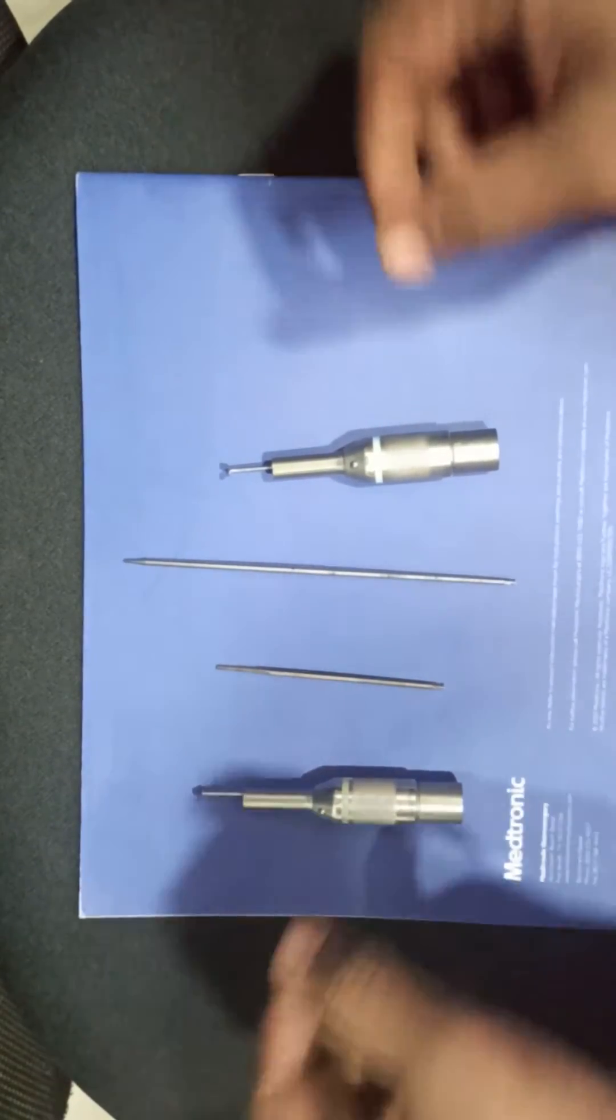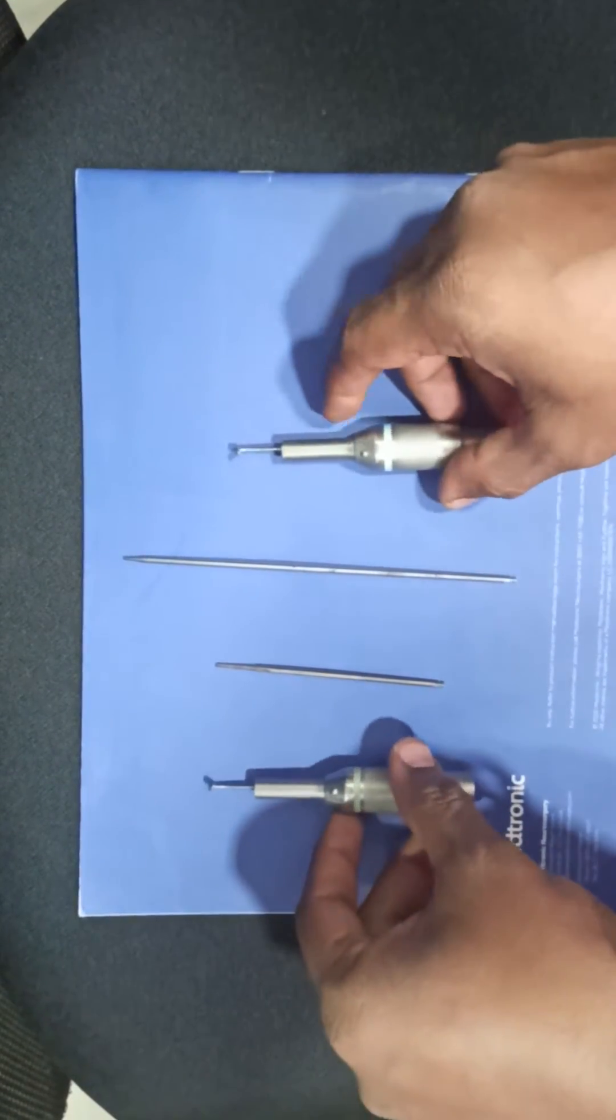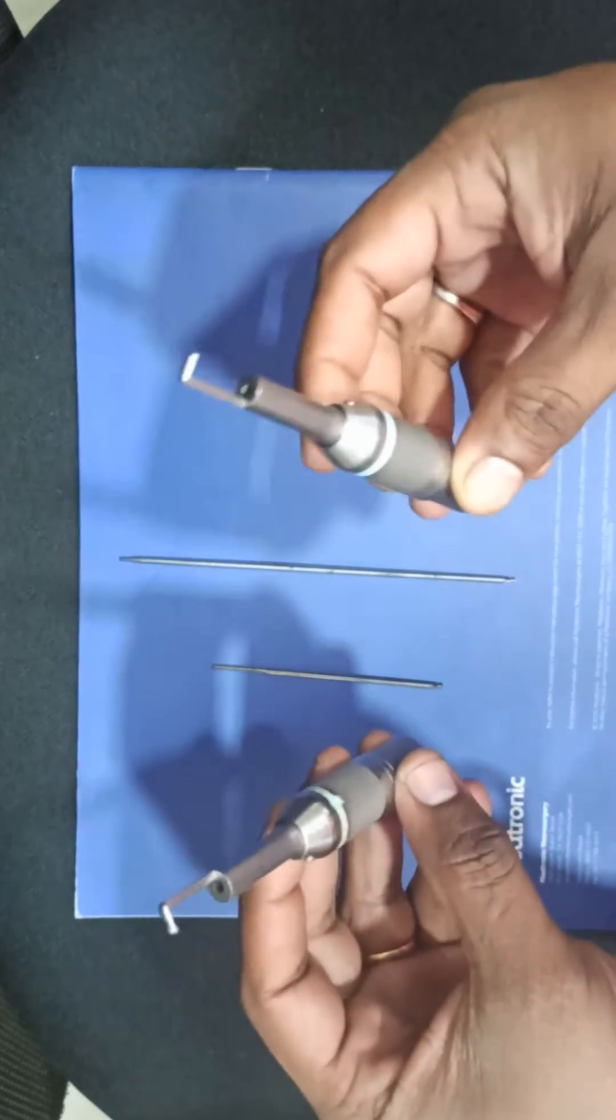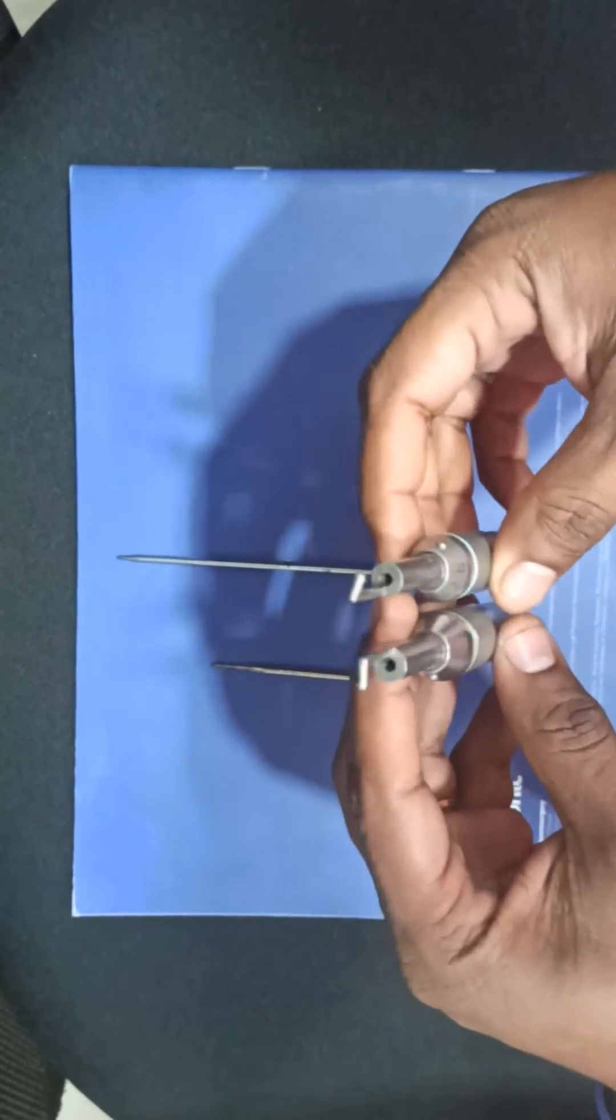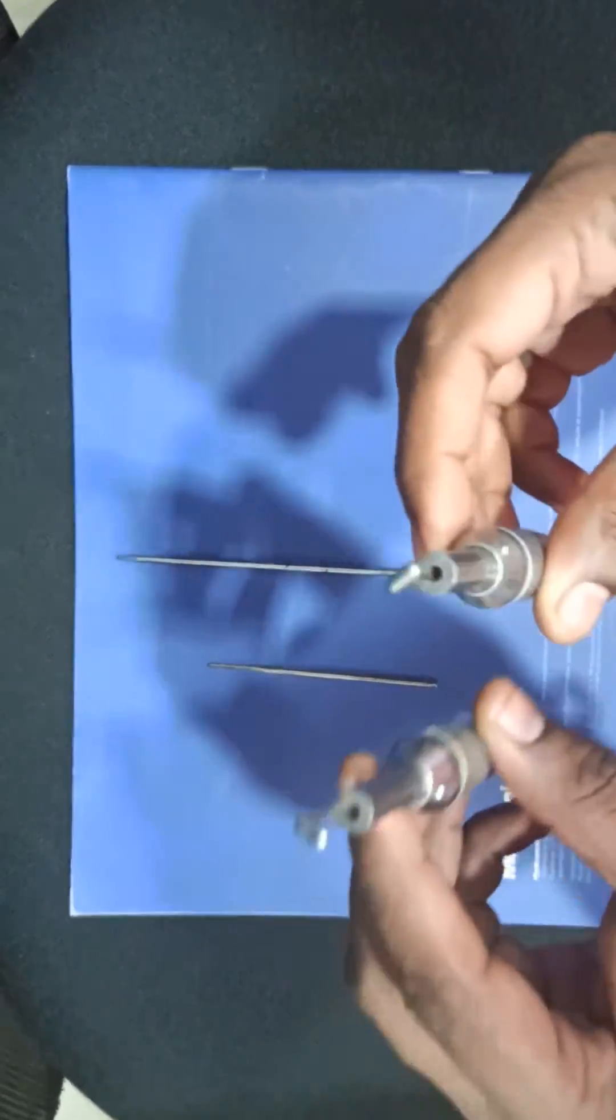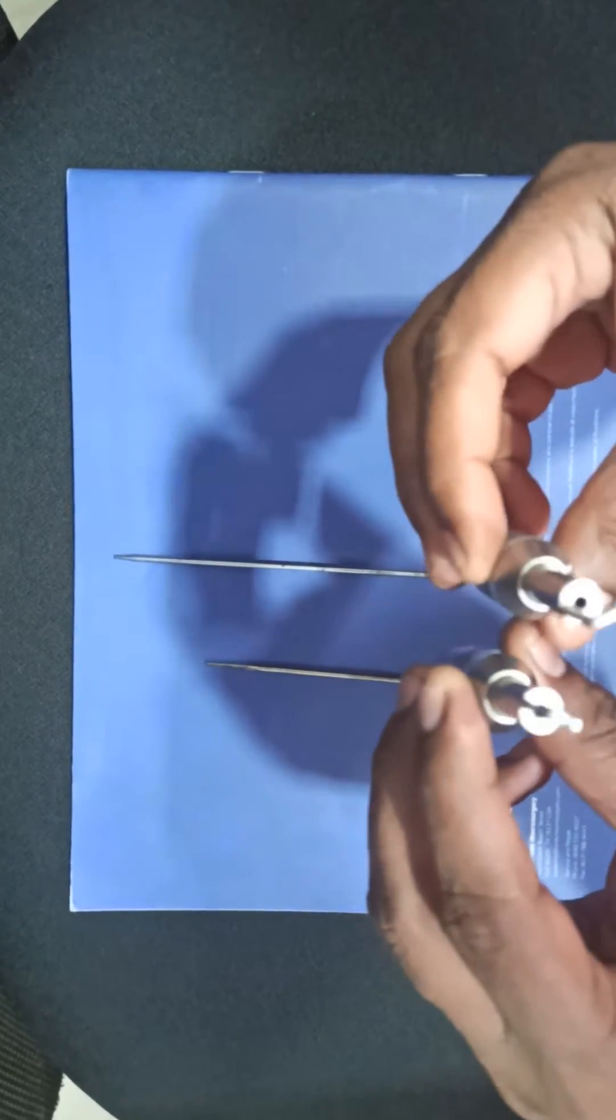Good morning to all. I'm going to demonstrate how to check the AF02 attachment. I have two attachments here - one is defective and one is working good.